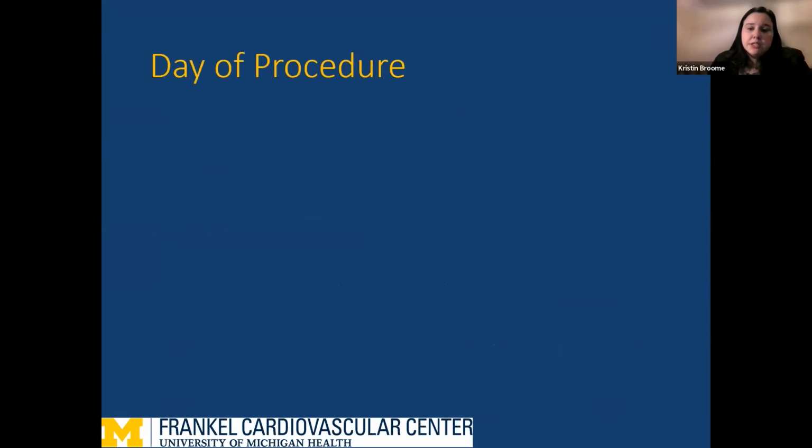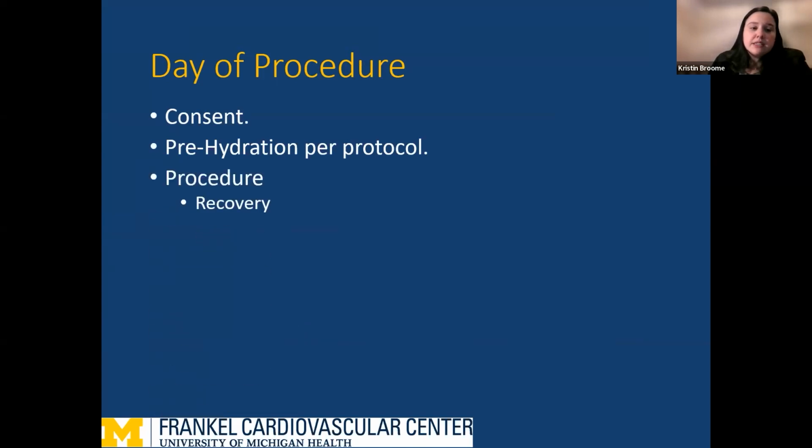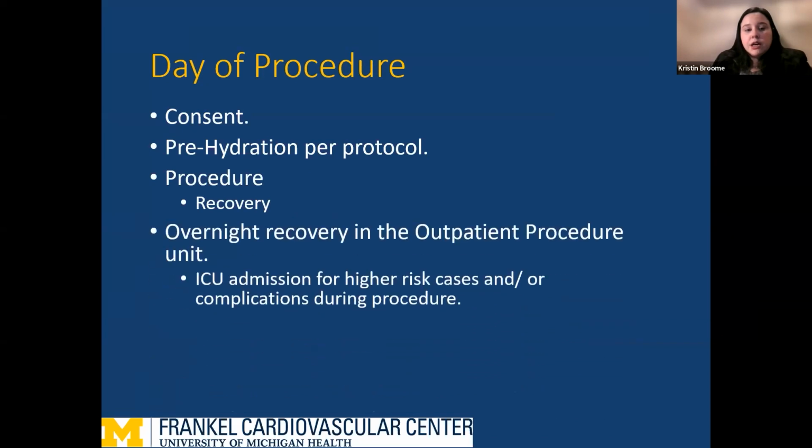So on the day of the procedure, the patients arrive to our cardiac procedures unit and follow the standard process. So they get consent from our advanced practice team. They get their prehydration per the protocol, and then they go to the procedure. So after the procedure, they will recover overnight in our outpatient procedure unit, which is in our cardiac procedures unit.